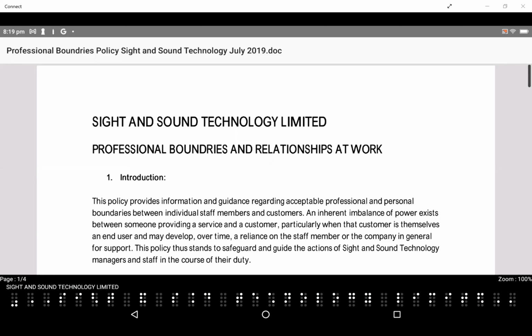Task name, Notepad, 3 of 4, list item. And I'll scroll up to word processor. Task name, word processor, 2 of 4, list item. I'll press Enter. Employee supervision and support. And we're back to employee supervision. So this is potentially quicker.